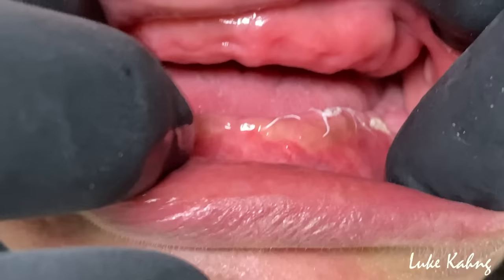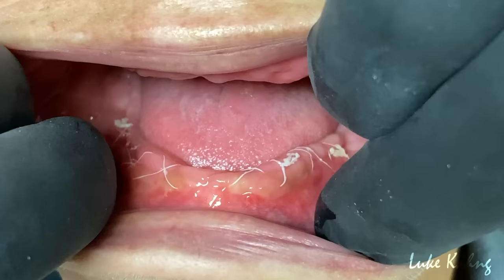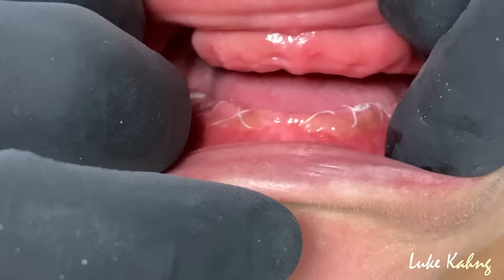So she went to another office and she came back to us because she couldn't even put in her denture. We had to do an alveoloplasty and reshape her entire lower jaw, which should have been done the day that they extracted the teeth. So we had to go back in there, open everything up. She's healing beautifully. She didn't have any discomfort, which for surgery like that, is pretty invasive. But right now, she's healing nice, and we're gonna get that upper and lower denture in.